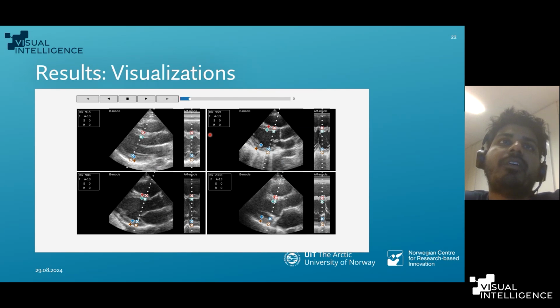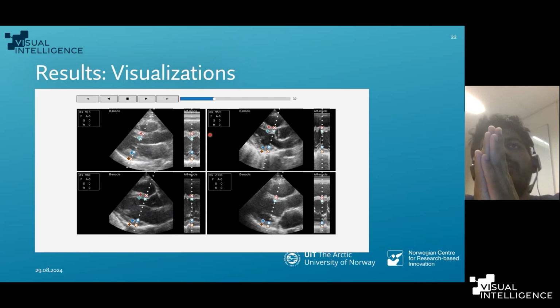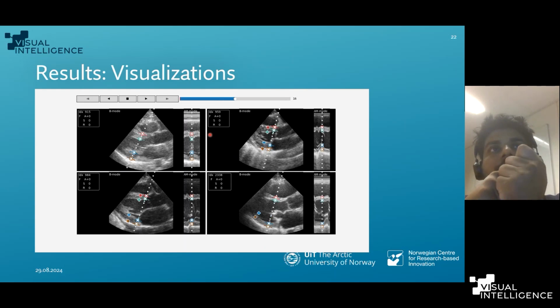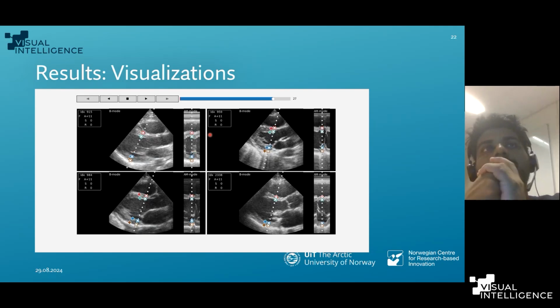So now I would just say the previous analyses were done where we know that the scan line provided at training and the scan line provided at test are identical. That is the only way to compare the B mode and the AMMs.